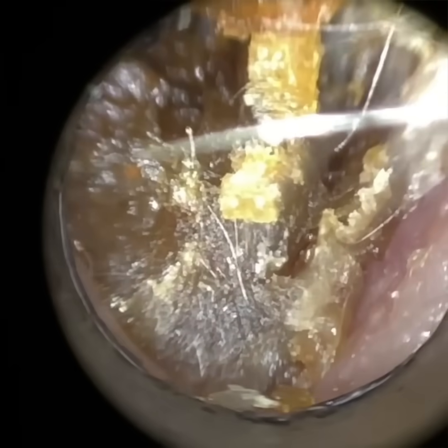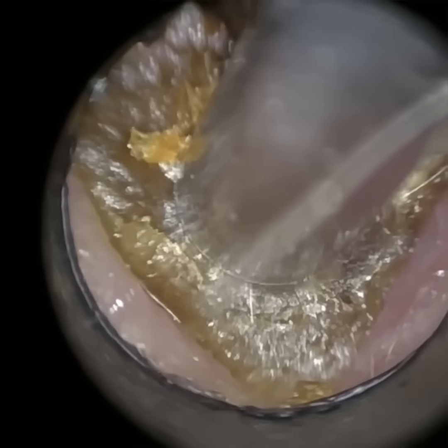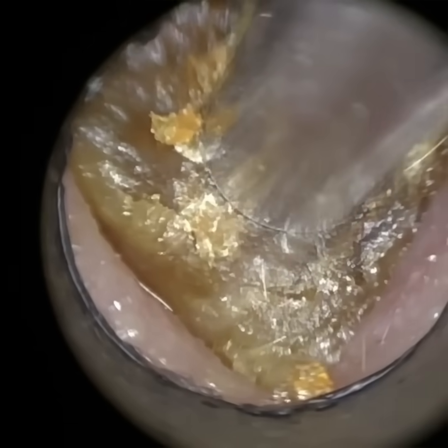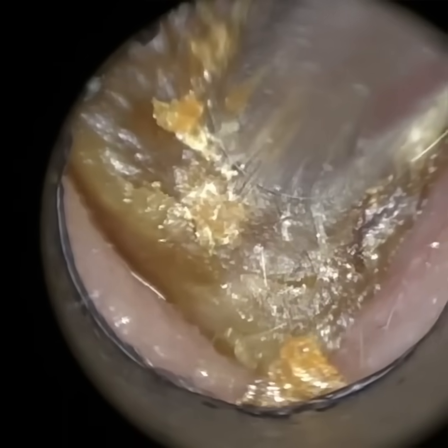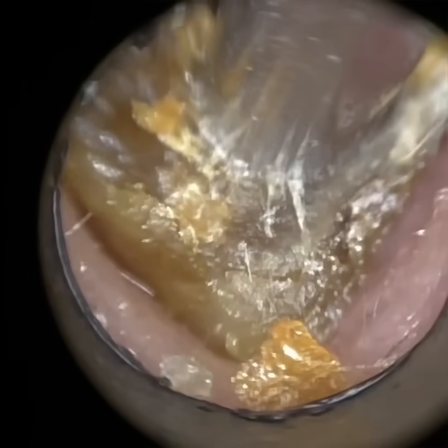I'm using the 4.25 millimeter internal specula here to help dilate the ear canal. We have a smaller size, a 3.5, and two larger sizes, a 5mm and a 5.75. And with the suction, you see I've got a good suction grip here, and I'm slowly trying to bring this forwards, almost trying to bring this over a little ridge on the base of the ear canal, and it just wasn't powerful enough to do that.